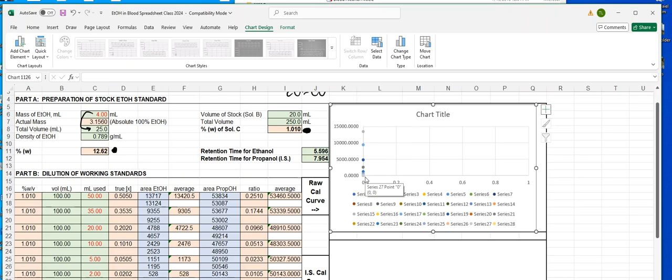So here we get a moment where maybe I have done cal curves, maybe I've highlighted data, I've built graphs around it, it's not a big deal, and then I try to do that here and I can't get it done. Something is wrong, something is off. I'm not doing this the proper way. How on earth am I supposed to build a calibration curve with these numbers separated that way?